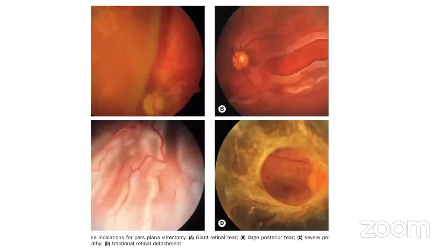So these are a few indications for PPV as a diagrammatic view. Giant retinal tear in the first case and large posterior tear. Here you can see severe PVR changes and tractional retinal detachment, which is involving the foveal region also. So these are a few indications.